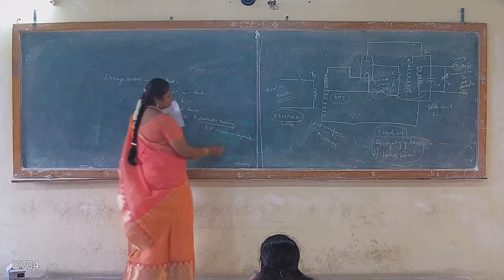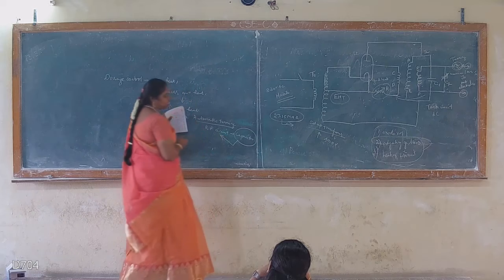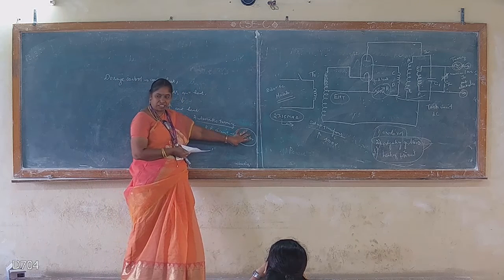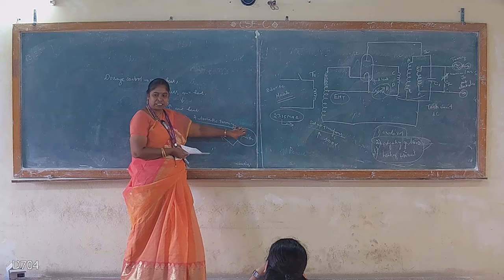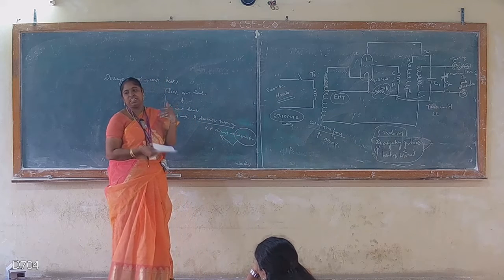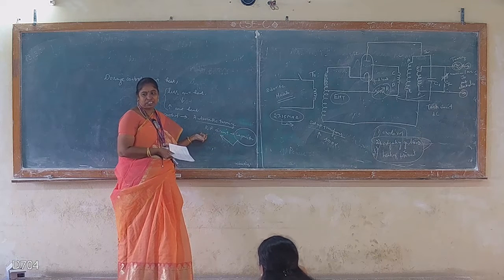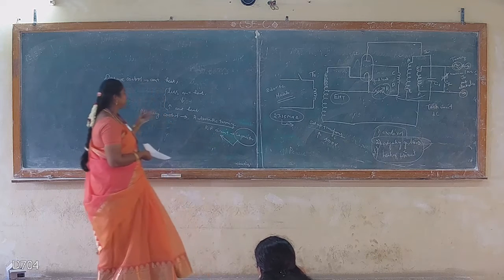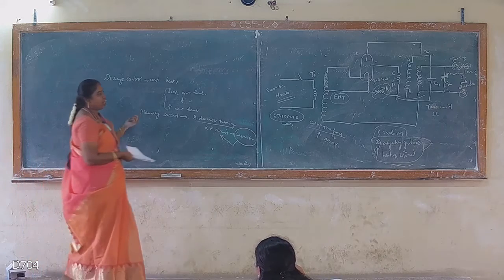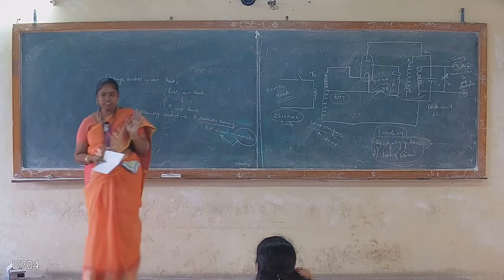So based on the capacitor amount of voltage, the RF frequency generation is going to be varied. This capacitor voltage is being sensed from the patient area. Accordingly, based on how much voltage is sensed, the particular RF circuit can be tuned, so that automatic tuning is also possible. If you want automatic tuning, one additional RF circuit along with the capacitor is enough.